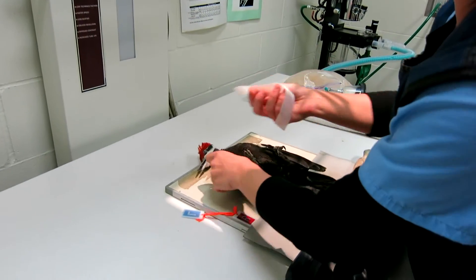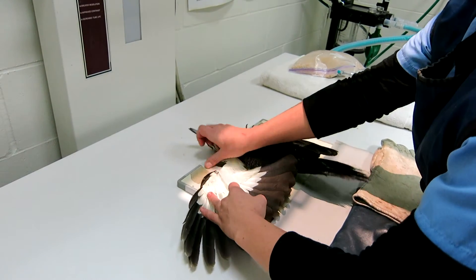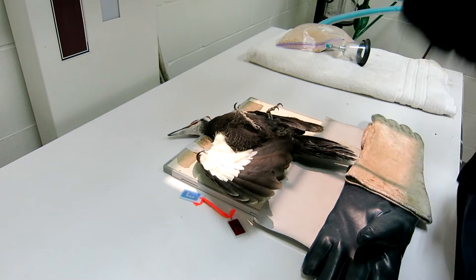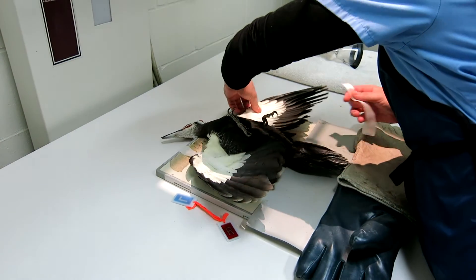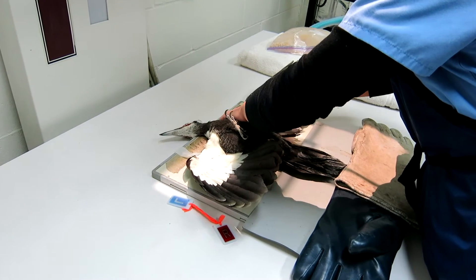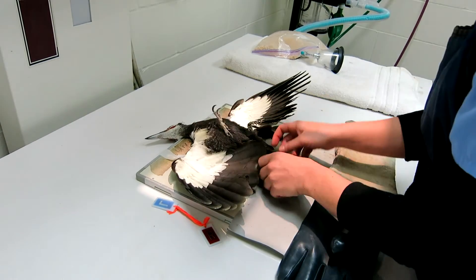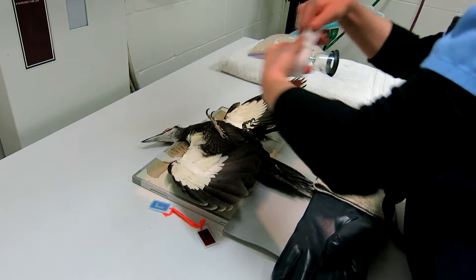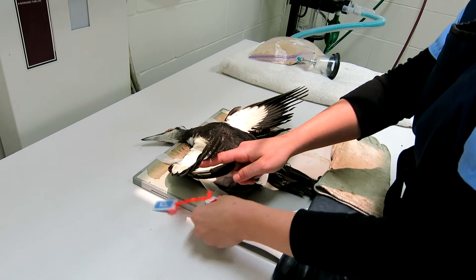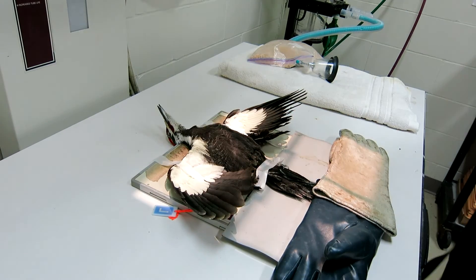I will tape him into proper positioning — we just use tape here. You want to stretch it out as far as possible and try not to get all of his little feathers in there. Make sure he is as straight as you can get him, and then get his little feet out of the way. Okay, marker is in position, and we're going to go ahead and shoot our first film.